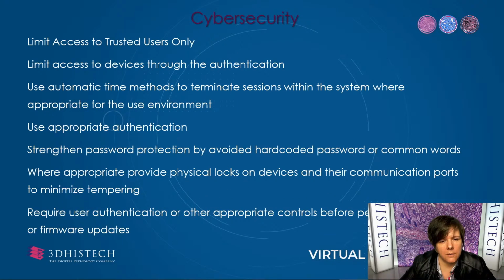The new IVDR regulation requires a new approach from the vendors. One of them is cybersecurity. Data protection is very important in this modern world. More and more regulations are in place to protect personal data and identify individuals who have access to diagnostic systems. I have collected the main needs of the regulation.